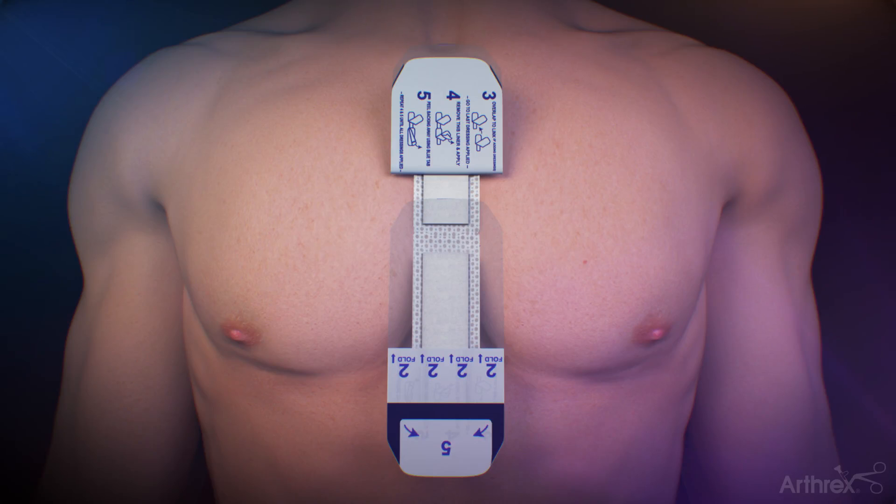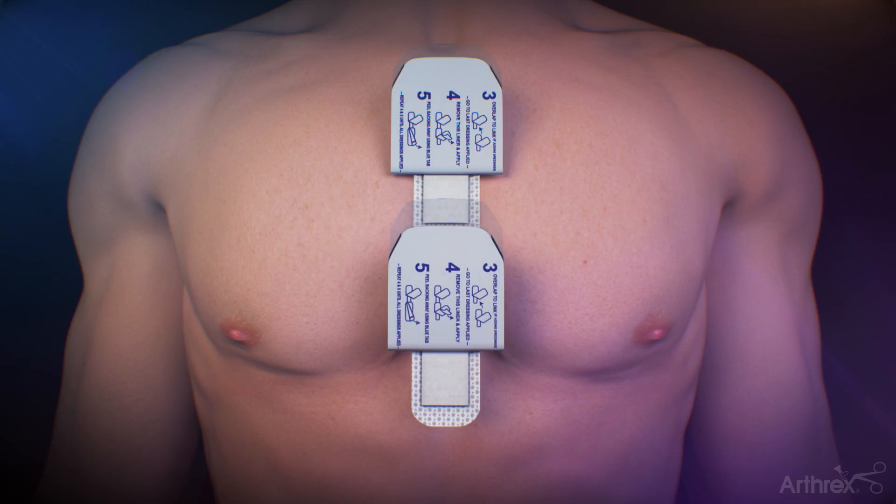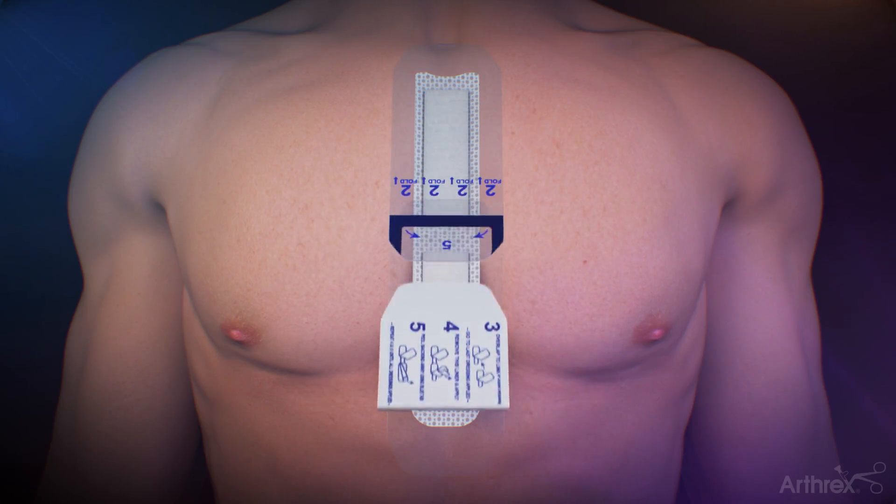Once linking the dressings together is complete, fold back the liner labeled 2 on the second dressing and remove the liners labeled 3, 4, and 5. Affix this adhesive layer down onto the skin. Once smoothed down, remove the blue tabs to remove the backing. Repeat the same steps with any additional dressings.